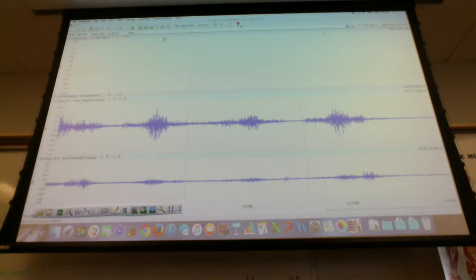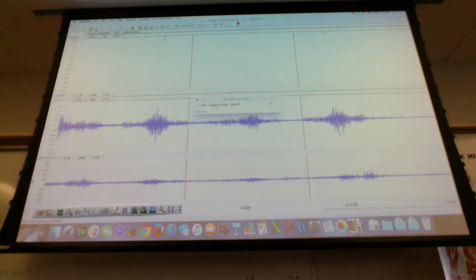So what we're going to do next is get an idea of the size of this. It's easiest if I just show you on the first script over here. First of all, you're going to go into analysis mode. So you're going to come over here, and there's something that looks like a little magnifying glass on a chart. I'm going to hit that. Is everybody there? You should have two red lines. One, two. Does anybody not have two red lines? They may just have one. Okay, good.